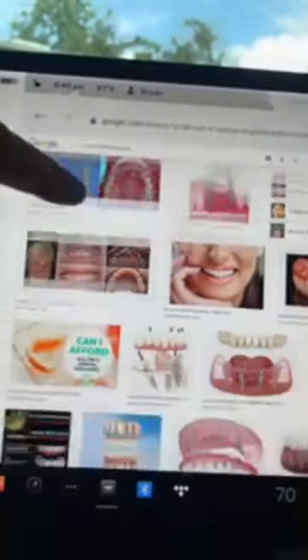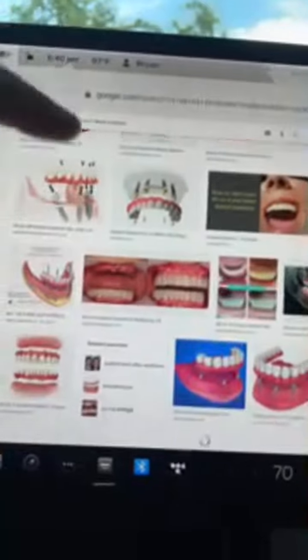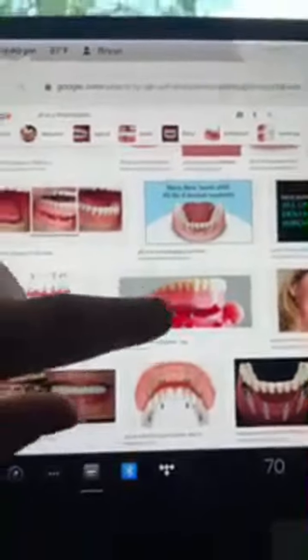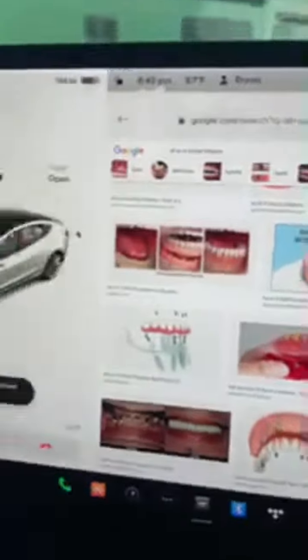Well, again, going back to this one picture here that shows an overdenture. Let's see, where was that? Oh man, it was here. So here, because there's so much more surface area, your ability to trap food in there is much higher. So that's probably the biggest thing. When you're chewing and eating, you have a bigger chance of getting food caught in there, which drives you crazy, and then you have to go to the bathroom and rinse it out. That's probably the biggest complaint I would say.